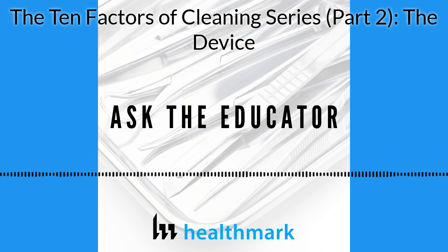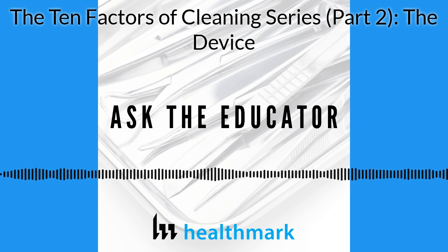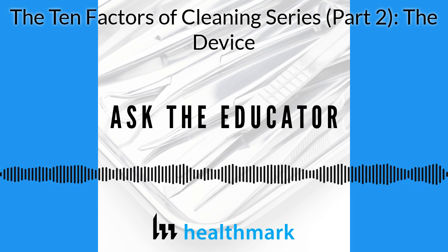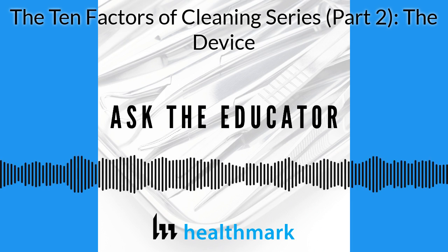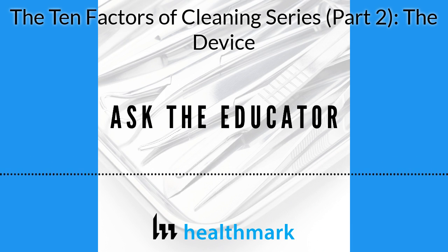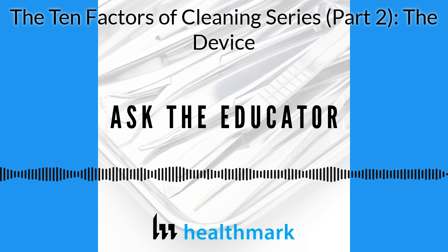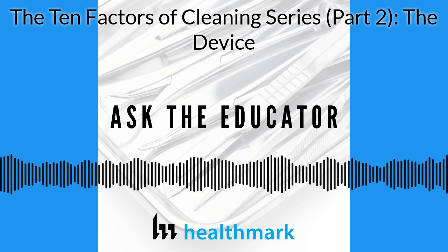No, I think that's a great start. I think, just hearing what you're saying about it, I would probably add one more category, and that would be modular, because there's complex devices that are all together. Like a robotic arm is one item, and yet it's very complex. But then you have sometimes simple items that are actually modular, and then you have to understand that it's an actual take-apart instrument. So it's like a step sort of in between.